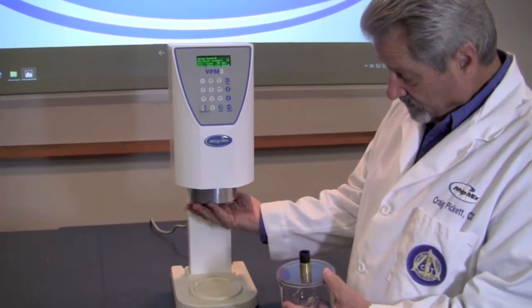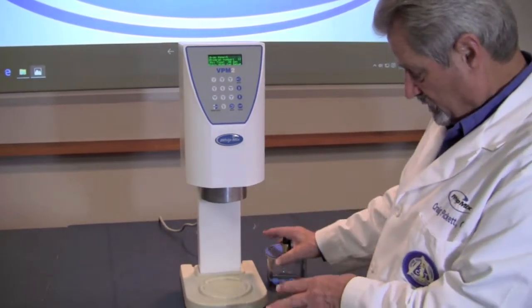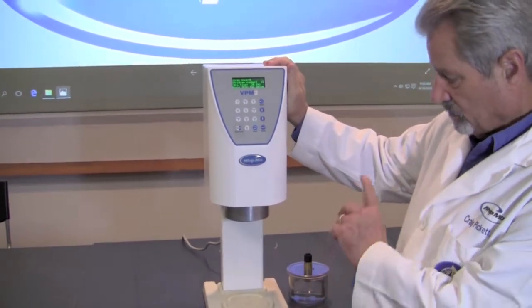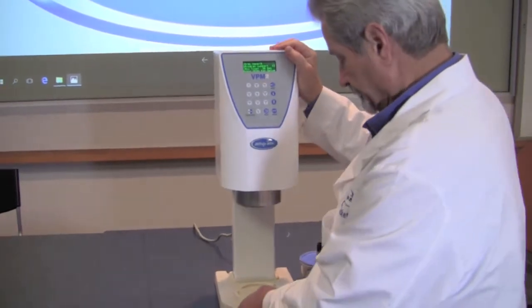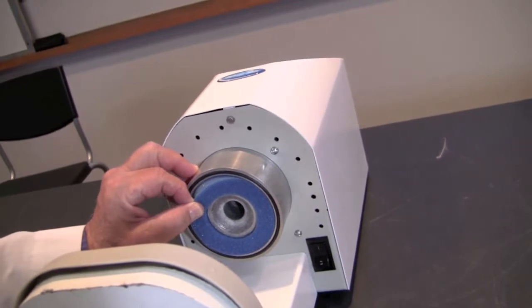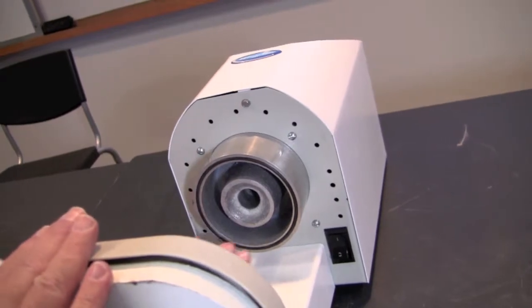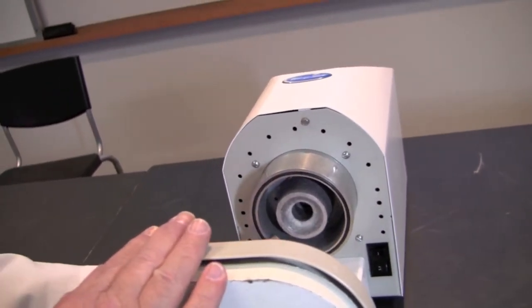Once we have established that that's not the issue, we want to see if the machine itself is having a problem. In order to do that, we're going to lay the machine back on its back. Once you have the machine on its back, remove the foam filter again and make sure that everything interior here in the throat of the machine is clean.